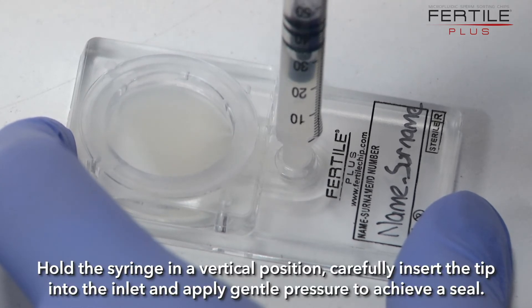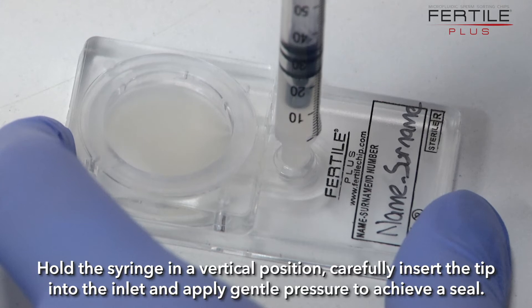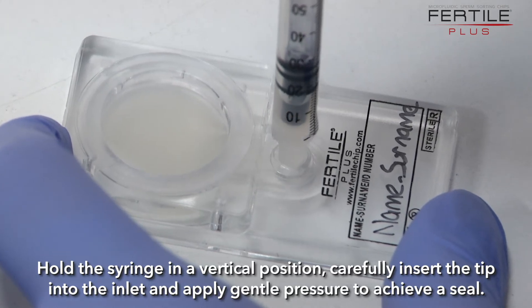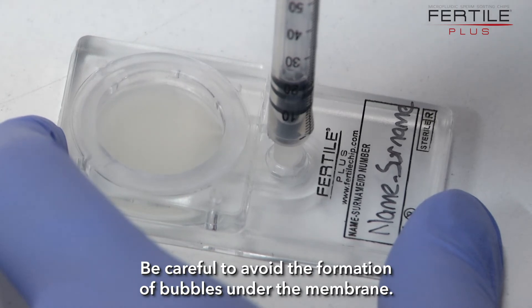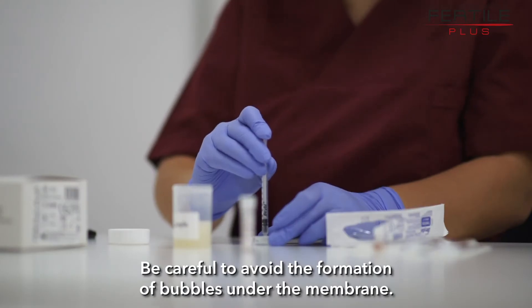Hold the syringe in a vertical position. Carefully insert the tip into the inlet and apply gentle pressure to achieve a seal. Be careful to avoid the formation of bubbles under the membrane.